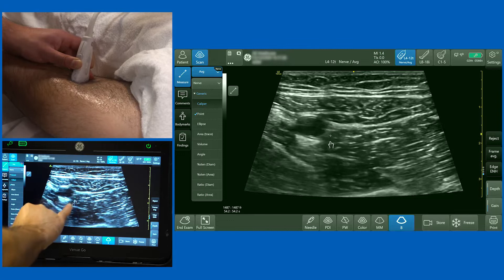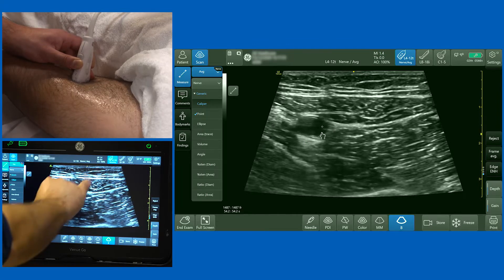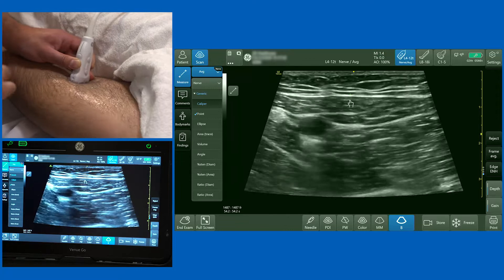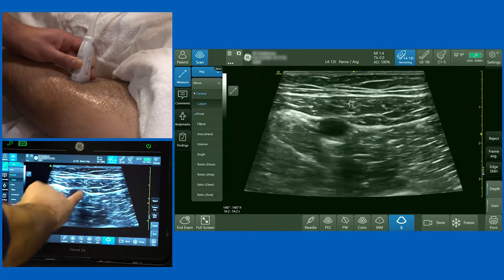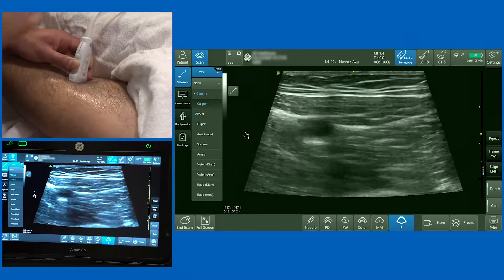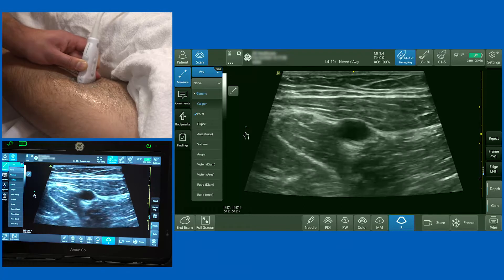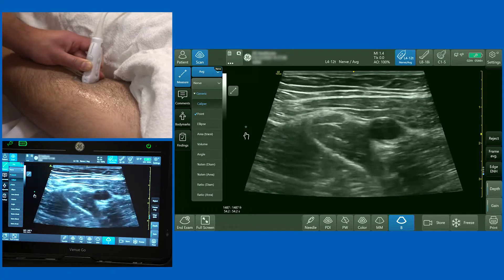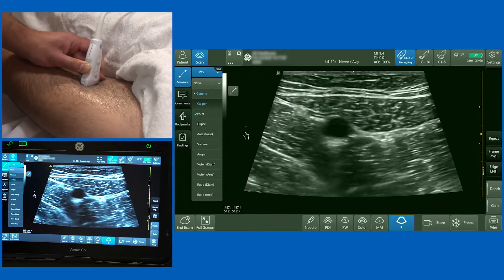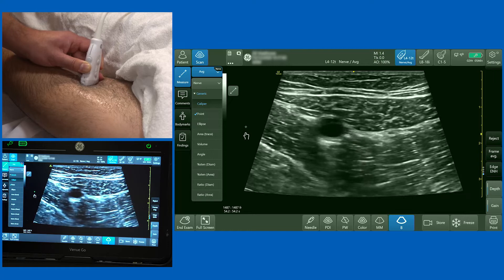I wouldn't drive your needle down here because the superficial femoral vein is lying there. I'm going to show you one more tip to orientate yourself correctly, because there's a structure involved with knee analgesia which it's important not to miss — and that's the nerve to the vastus medialis.